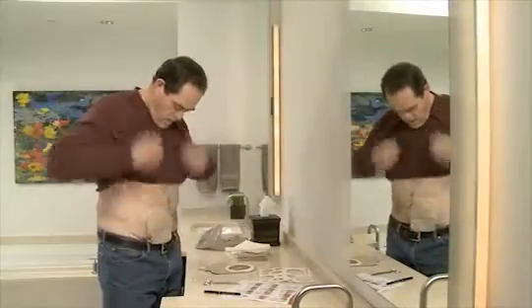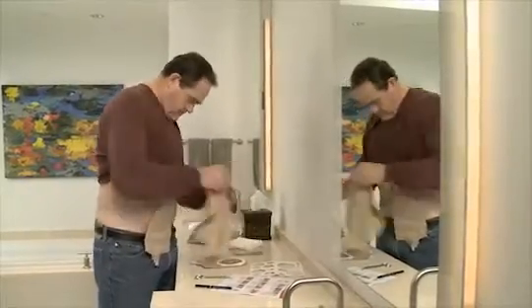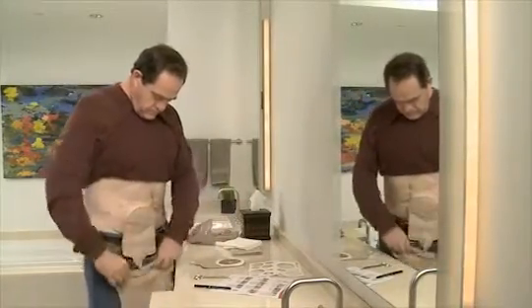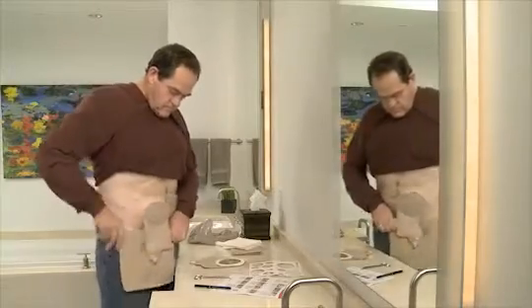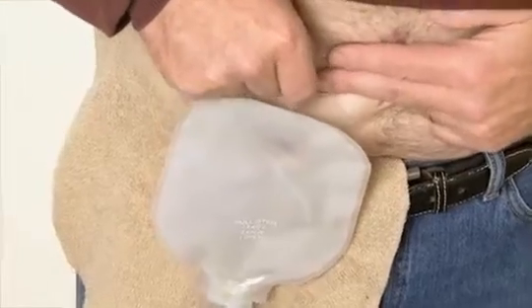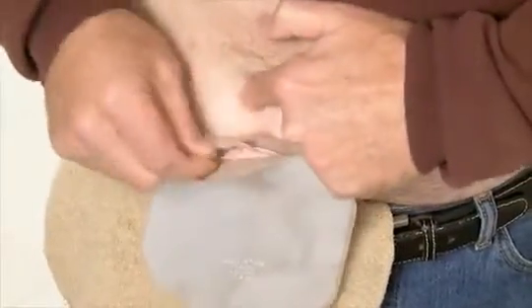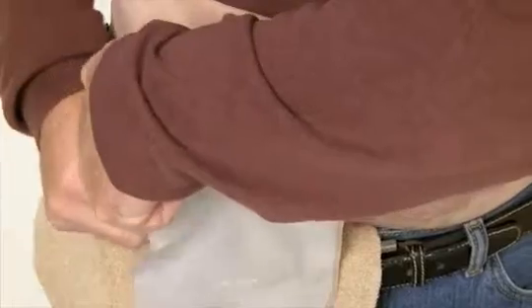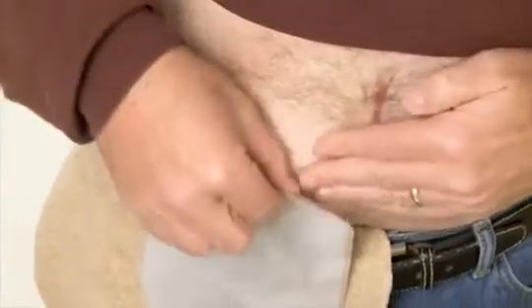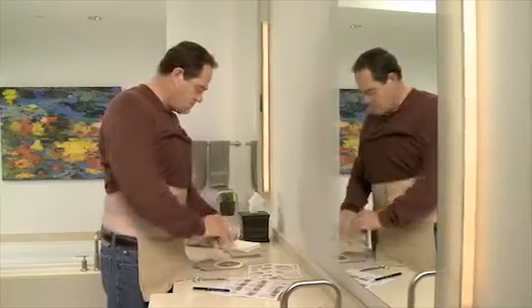Now it's time to remove your used pouch. It's easiest to empty your pouch before you remove it. When taking your pouch off, carefully lift an edge of the adhesive and peel downward, gently pushing the skin away from the skin barrier. Properly dispose of your used pouch.